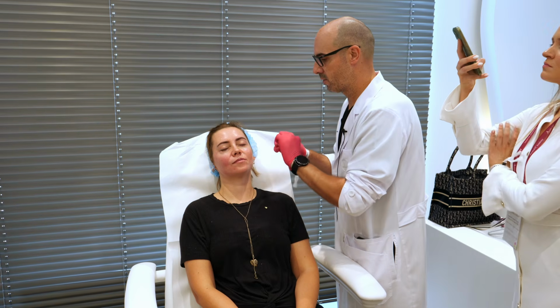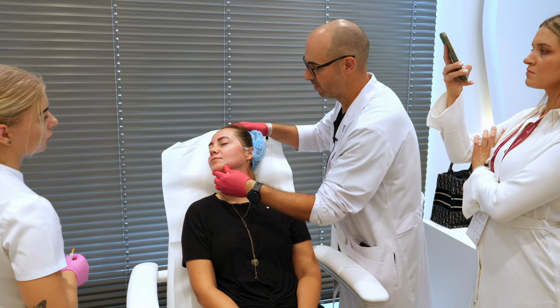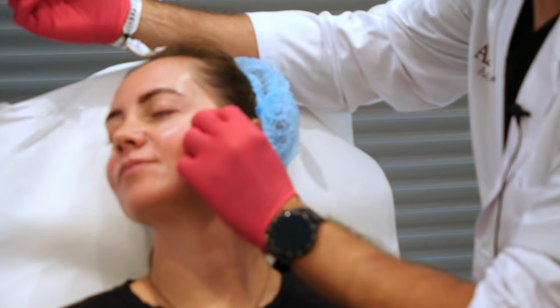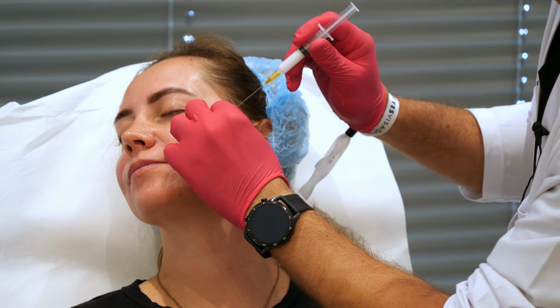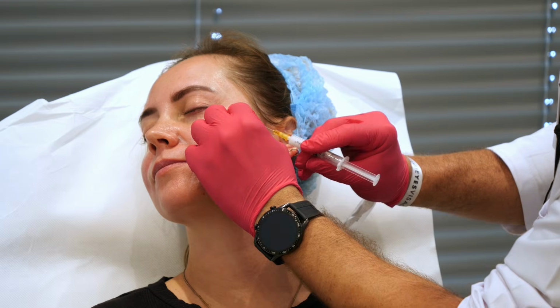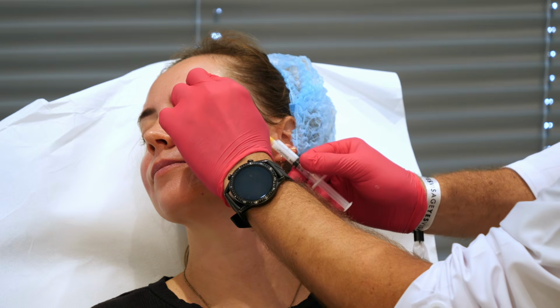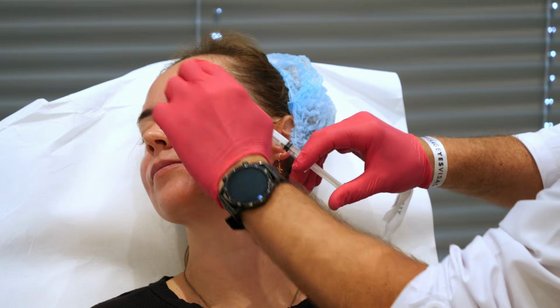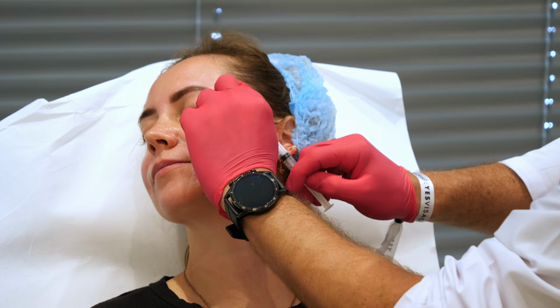Okay, another entry point, the same, on the other side. We go to the temple. Slowly. You can see I'm in the plane, to the frontal suture here, and I put the retro vector only in this zone.